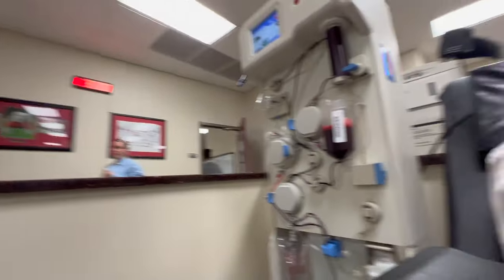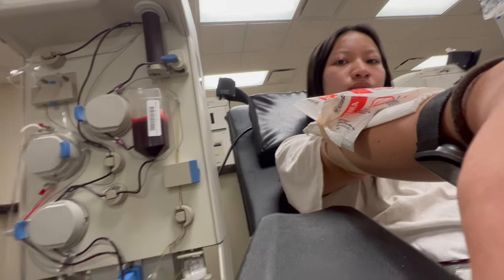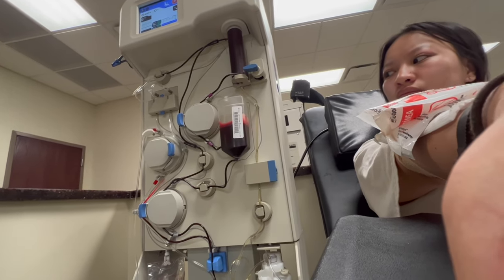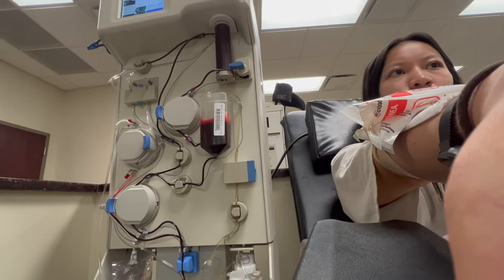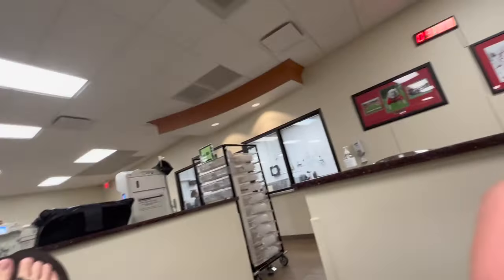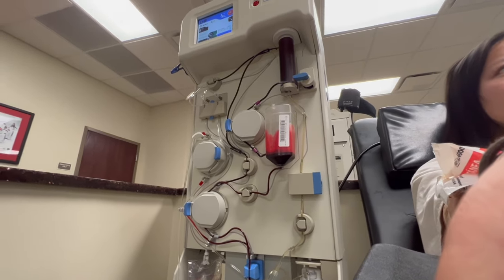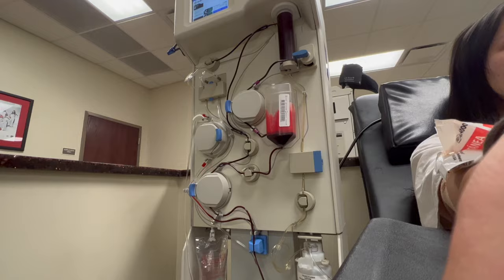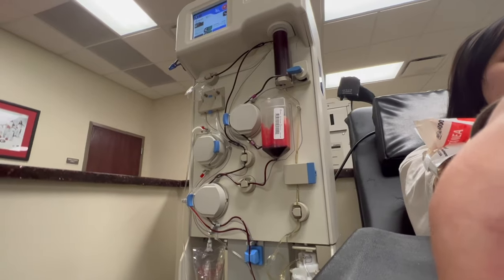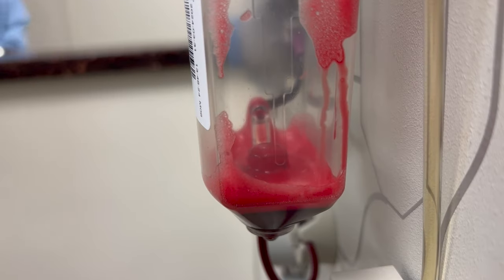This is the machine that collects the blood. That tall tube on the top right is the centrifuge — it spins to separate the plasma from the red blood cells. The container in the middle is the reservoir where your red blood cells go. That tube fills up and then your red blood cells are pumped back into your arm. This continues until your plasma bottle at the bottom right is filled to your designated amount — the plasma is that yellow liquid.